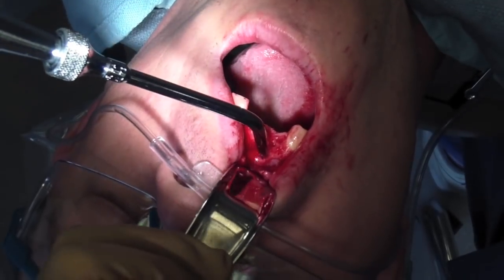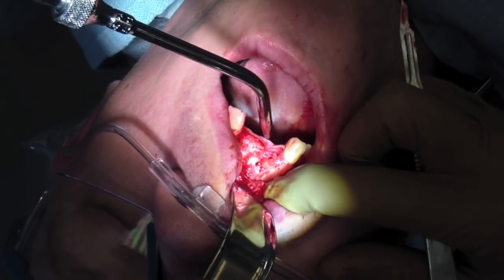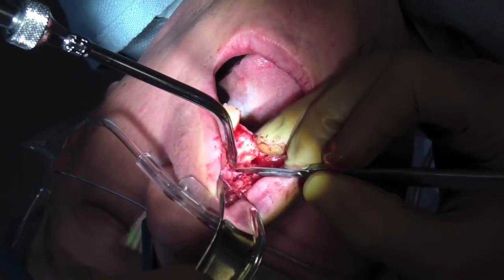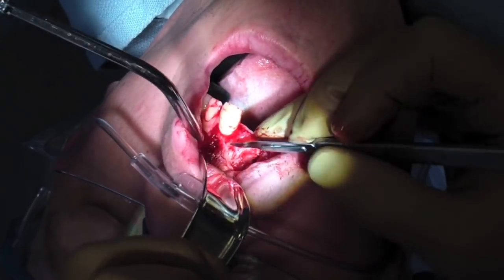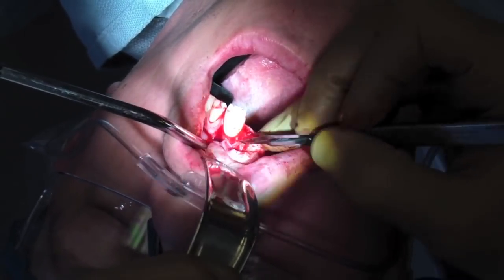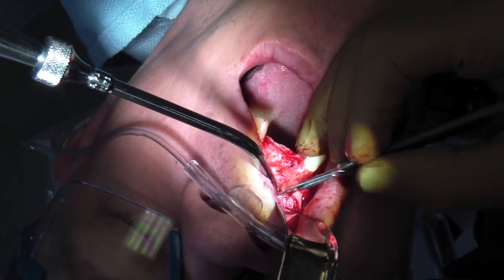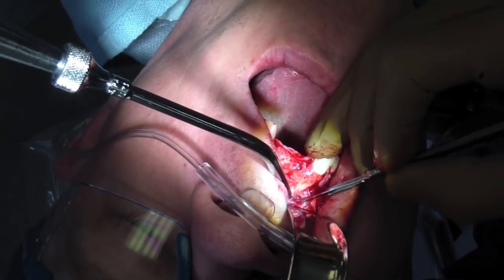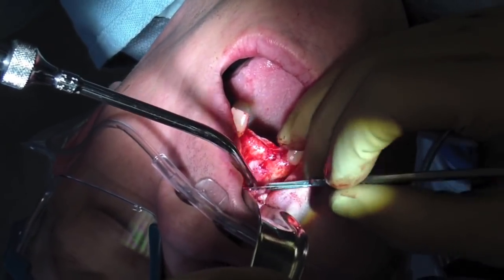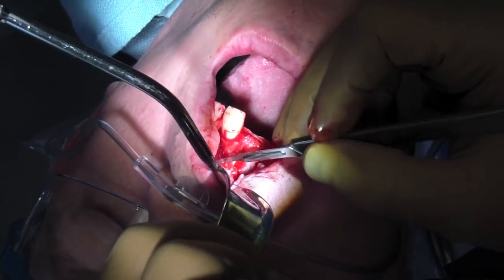Here you're going to be seeing the periosteal releasing incision. I have done one on a model so you can see. What we're doing is aiming the blade — the pointy end of the blade — towards the bone, so you don't perforate your flap. Essentially I'm just cutting away the periosteum. At the apical portion of the flap, I'm leaving the periosteum attached to bone and making incisions so I can take this whole flap and stretch it right over. I can almost imagine stretching that flap to his tonsils — that way I'm going to get primary closure.